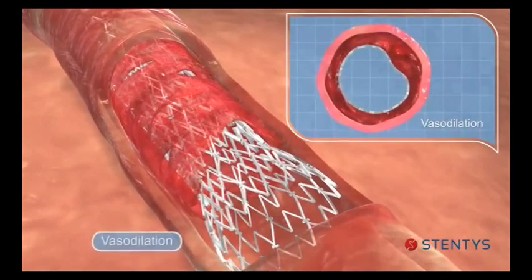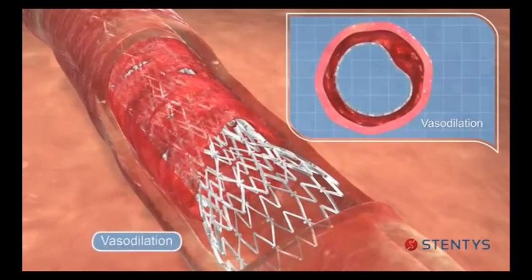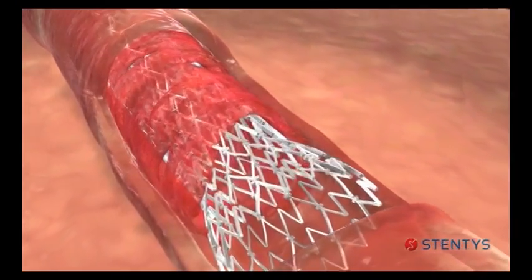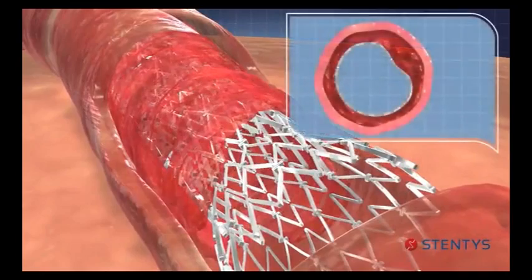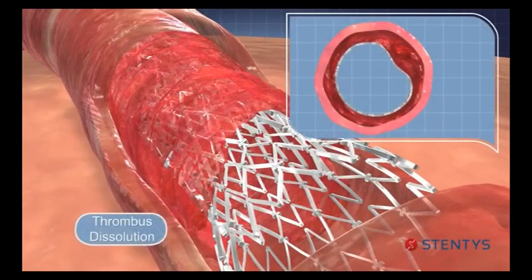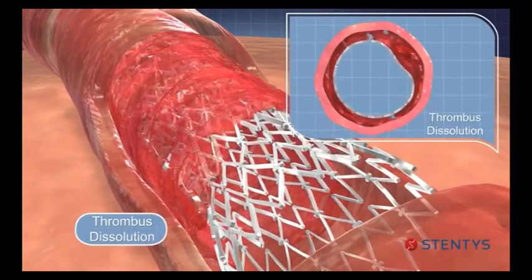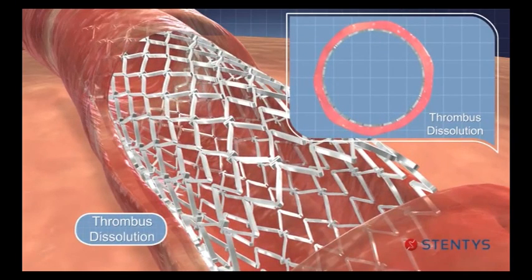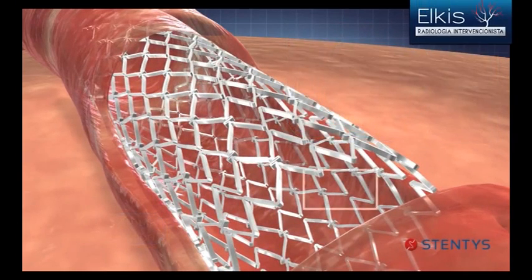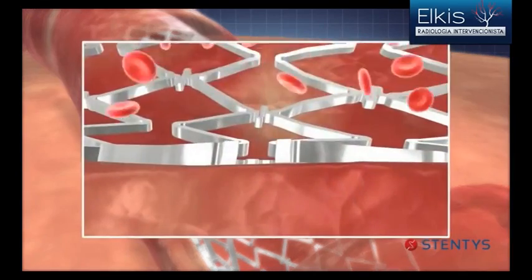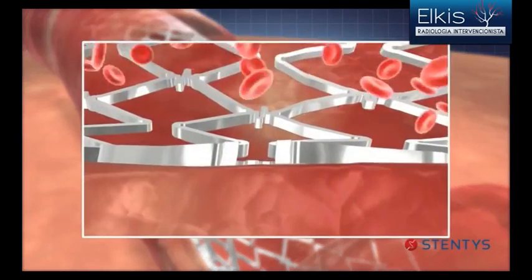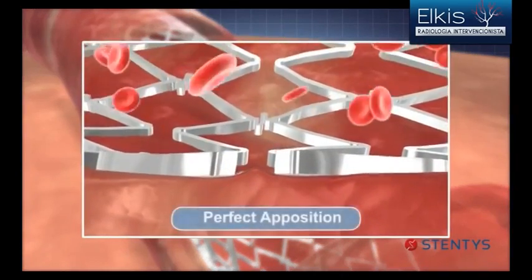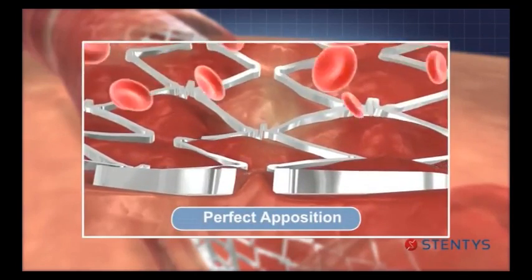As spasm is relieved, the vessel diameter increases and the stent follows in expansion, continuing its scaffolding of the artery. Finally, as the thrombus dissolves, the stent expands further to absorb the gap left by the dissolving thrombus, thus maintaining a perfect apposition throughout the remodeling process of the vessel.